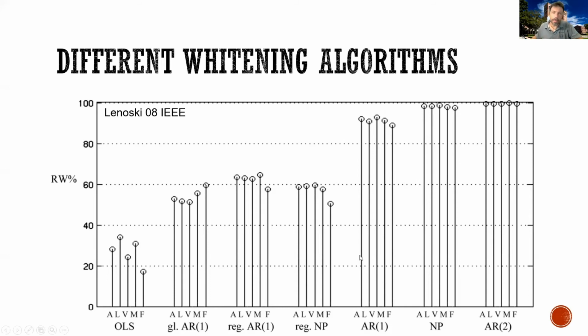On the other hand, this NP down here is what FSL does. And as you can see, it does an excellent job. We're really between 99 and 100% cleaning.